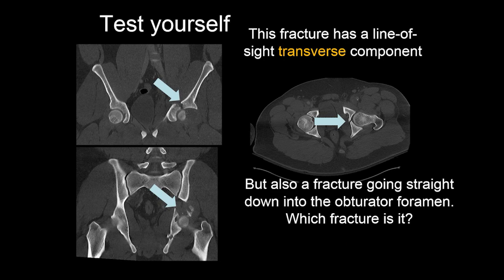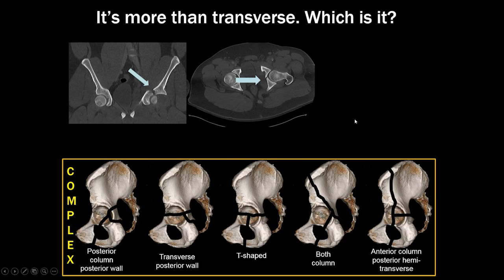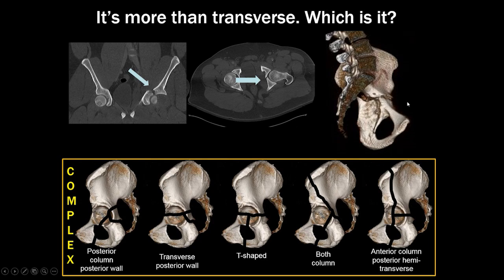Test yourself: this fracture has a line-of-sight transverse component going all the way from front to back, but on the axials there's an additional fracture going straight down into the obturator foramen. Line-of-sight component plus additional fracture into the obturator foramen — therefore this is a complex T-shaped fracture.